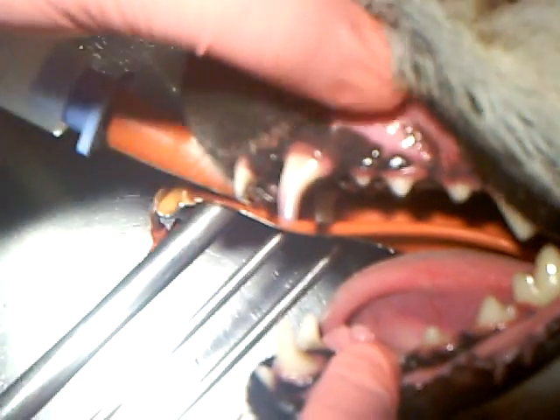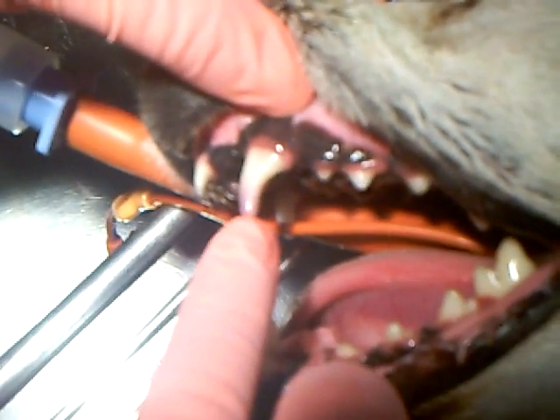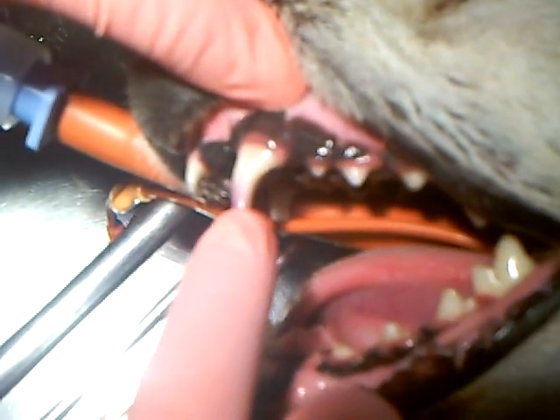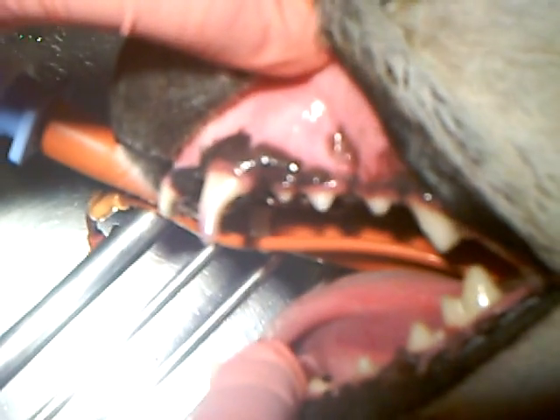Hi, I'm Dr. Missy Shardy. Today we're going to go over extraction of a canine tooth. This tooth here you can see has a purple discoloration. On an x-ray we notice that it actually has an abscess or an infection up around the root of the tooth.